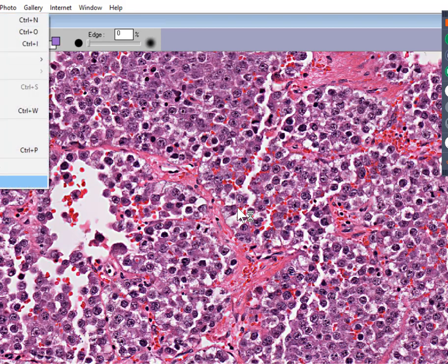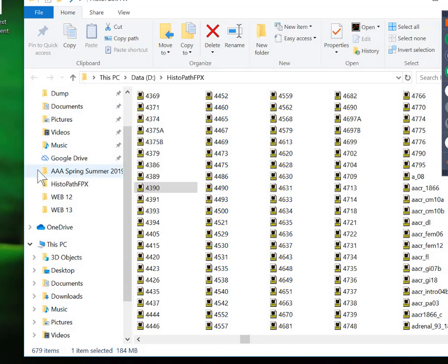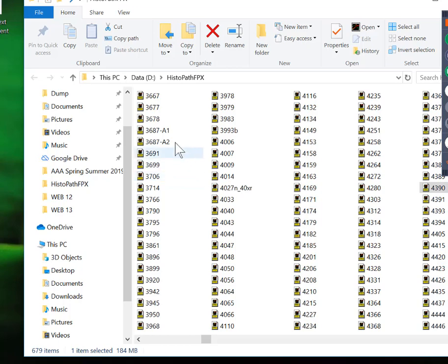I want to point out something very important, because we'll be dealing with this extensively when we go to our chapter on male. It's going to be slide number 3678. And slide 3678 is over here.